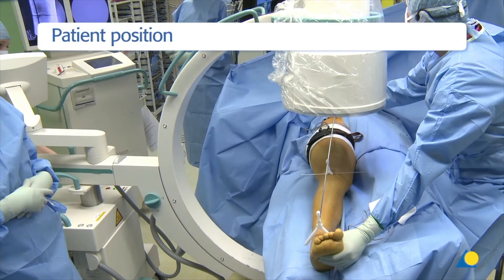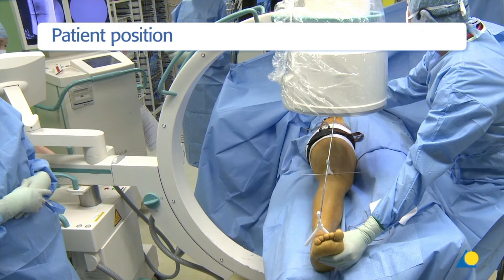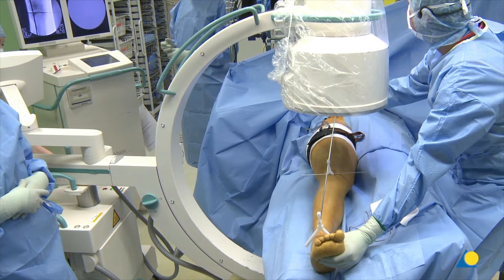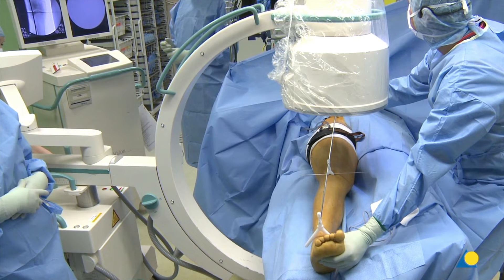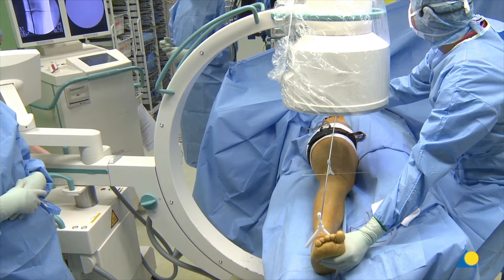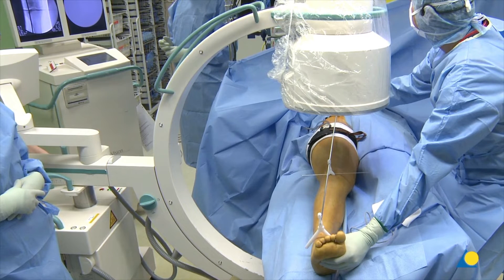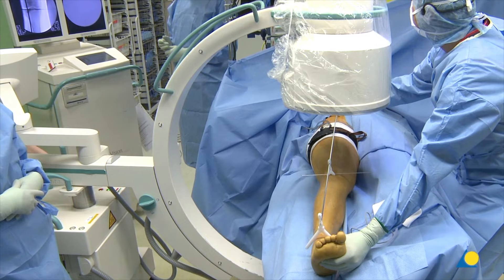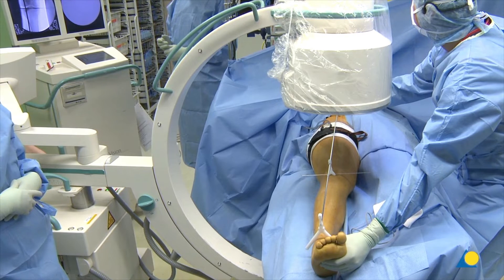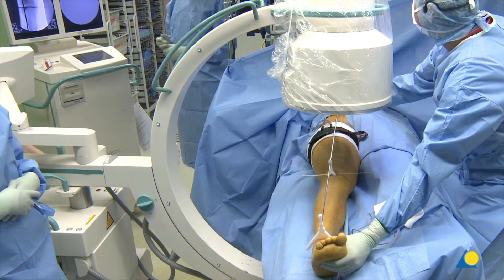The patient is positioned supine so that the hip, knee, and ankle joint can be visualized with the image intensifier. The contralateral leg is lowered at the hip joint to facilitate access to the medial distal femur. The sterile draping also exposes the iliac crest so that the leg axis can be checked intraoperatively. A sterile tourniquet may be used.